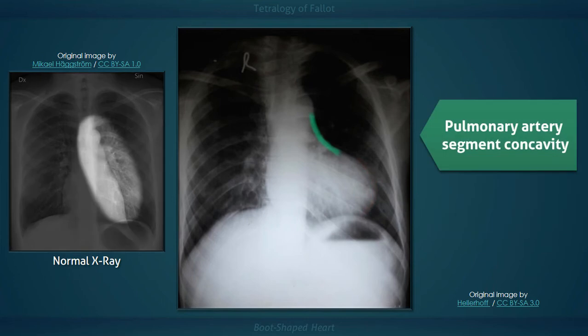Pulmonic stenosis can also result in a small main pulmonary artery due to decreased flow. This finding is depicted on the x-ray as an increased concavity of the main pulmonary artery segment.